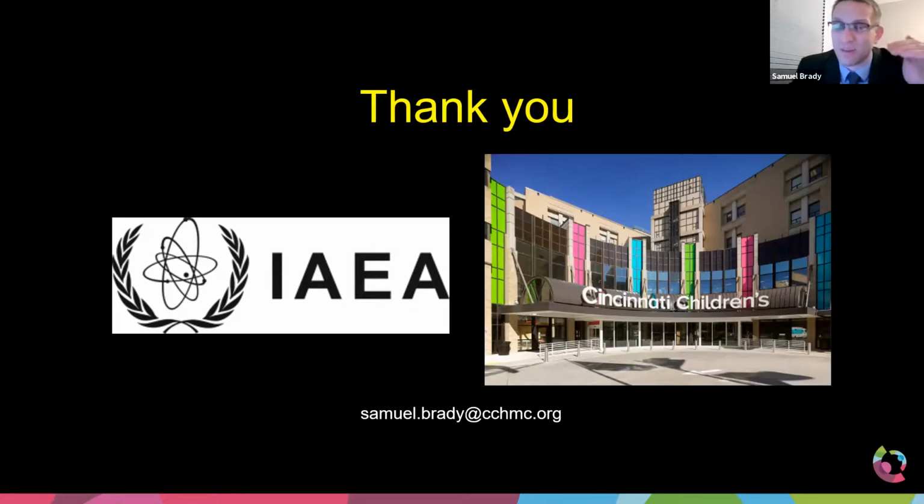But to determine the image quality, we can look at the EI value. Obviously, if you see the image and it looks very white, you have underexposed the image. But the metric called the EI value will also tell you that, because depending on the vendor, it might be really, really high, and then you know that your technique factor needs to be adjusted. And depending on how many techniques you have, all different kinds of body parts and different potential clinical indications will mean how many different parameters you have to adjust.